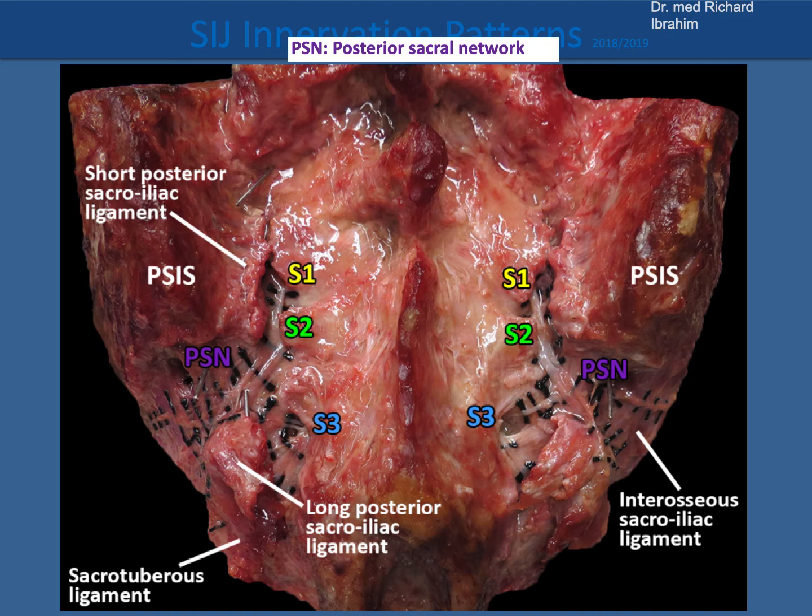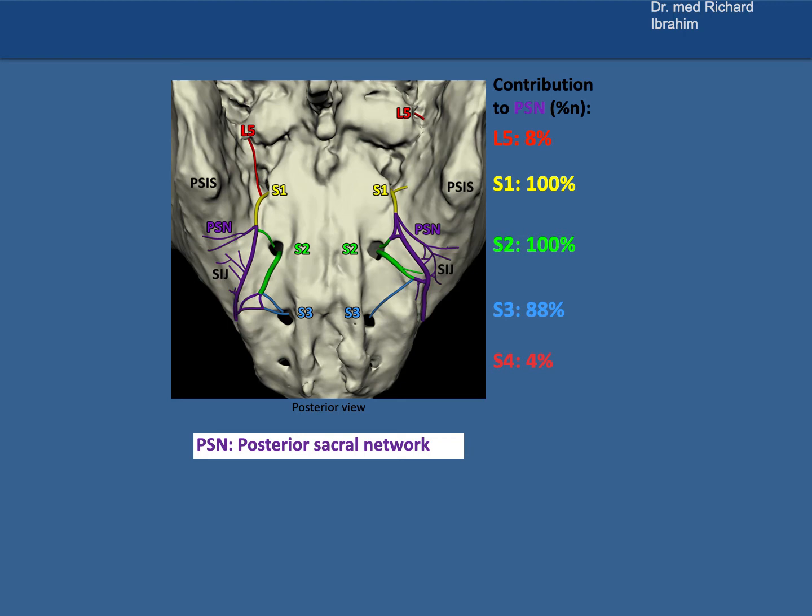So it gives you full information about pain in the area in 4 dimensions, and it also gives you the main area for pain perception for treating pain.